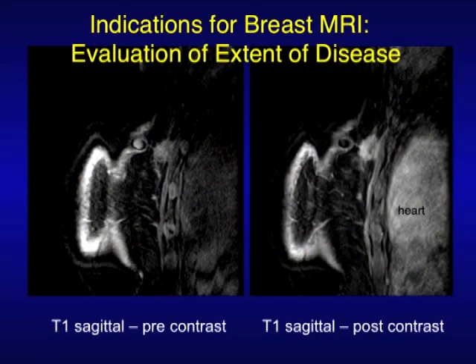Here's her MR showing — this is a sagittal plane, meaning you're looking at the patient sideways on her breast. And these are the ribs on end here. This is part of the heart. This is before contrast injection — that's the mass. That's a little vitamin E capsule we put on there, similar to the BB marker.